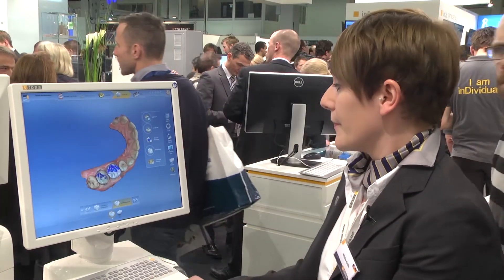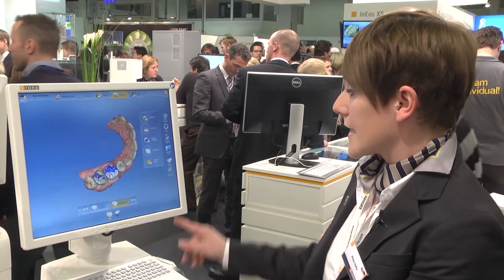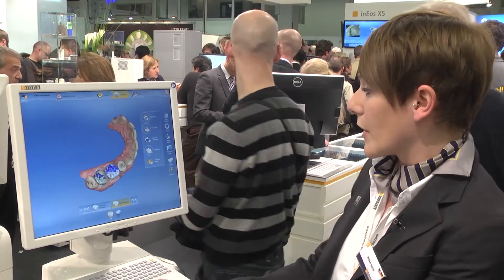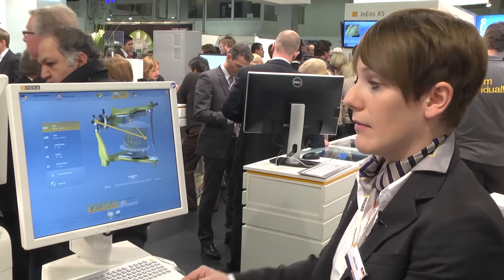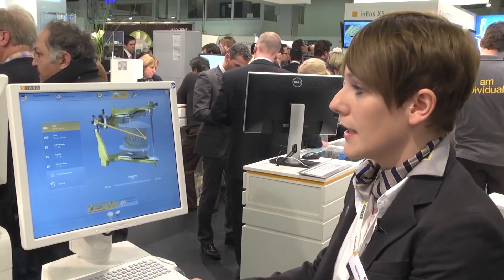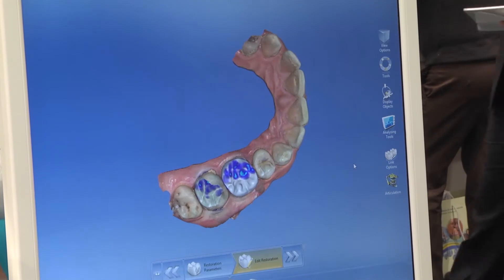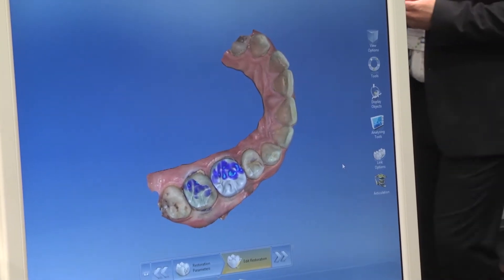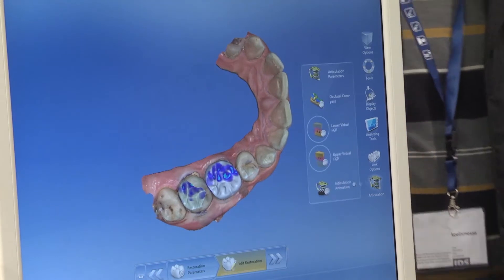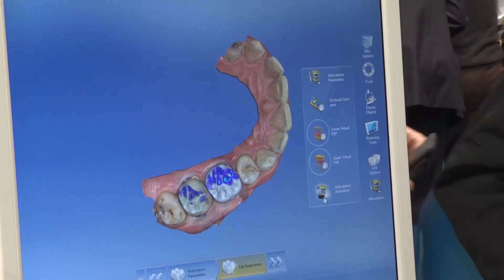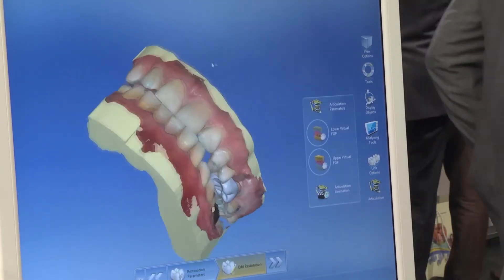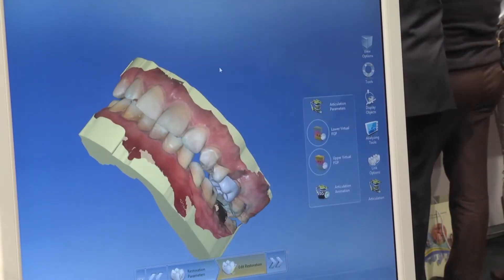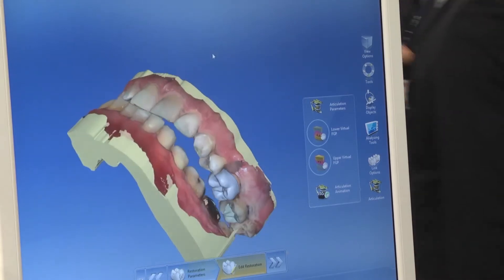For the articulator, you just click on articulation at the right, setting all the parameters which are available. In addition to the static contact surfaces, the articulator function also allows you to determine the dynamic contact surfaces and improve the correct functional occlusion.